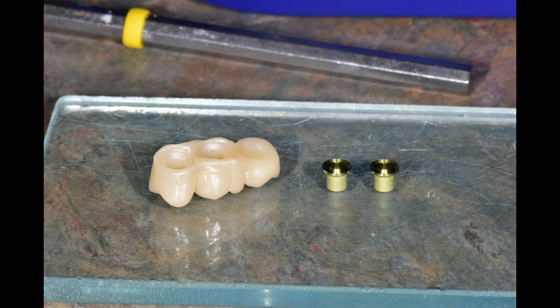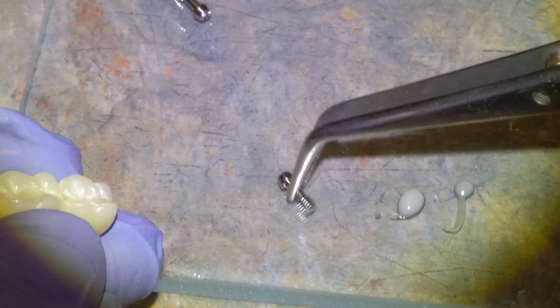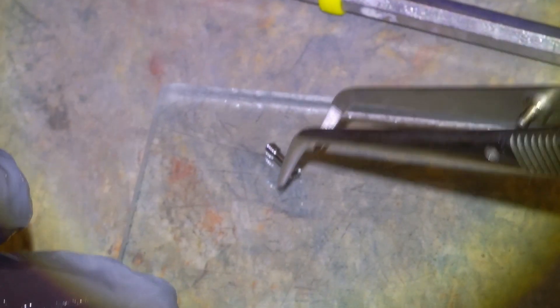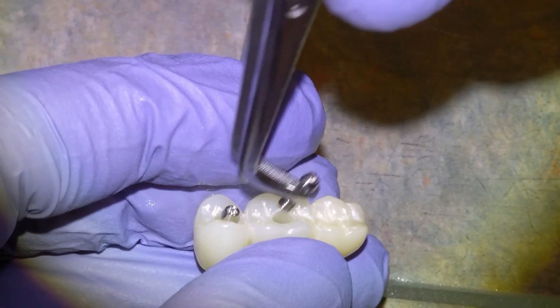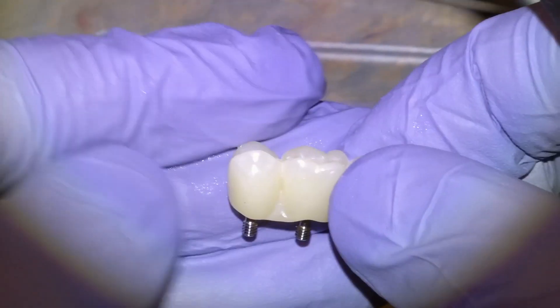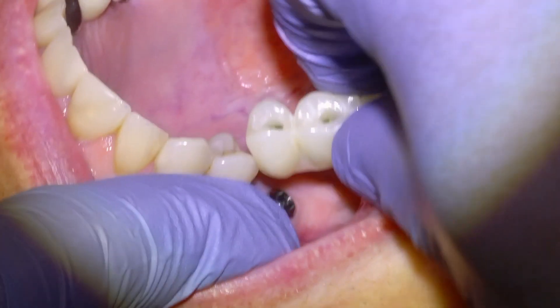We then take these little golden adapters and cement them into the cavities where the implants are, and this allows us to fix the bridge to the implants. We'll take our little fixation screws and place them down the screw channels that were programmed into the shape of the bridge, with the little screws poking out the bottom to engage with the implants.